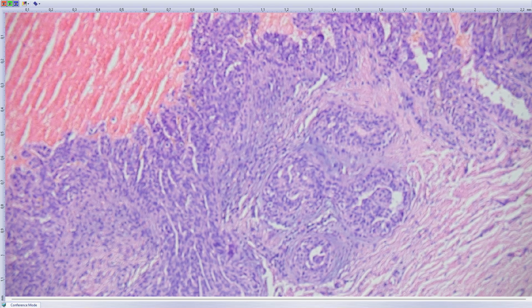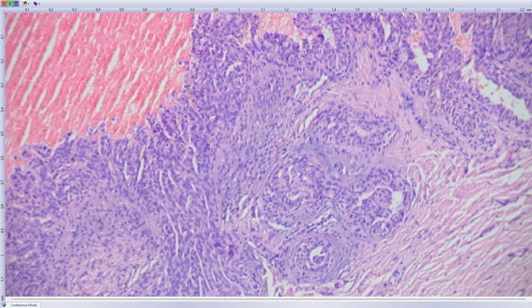Just the frequency of these lesions is very different from breast. I will show you in the future some various proliferations arising in anogenital glands of the vulva, because we published about these amazing lesions here for 20 years in the past.